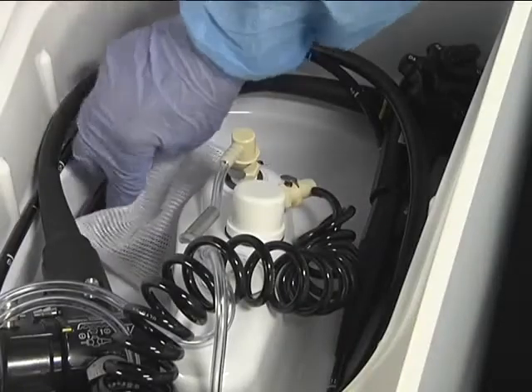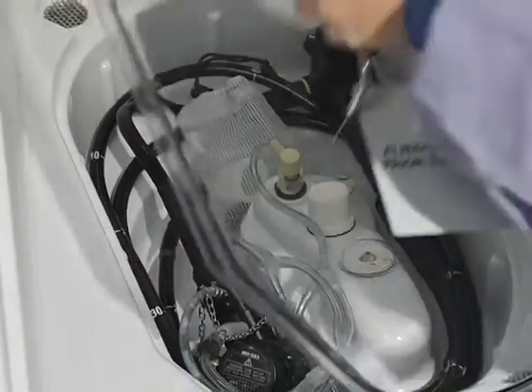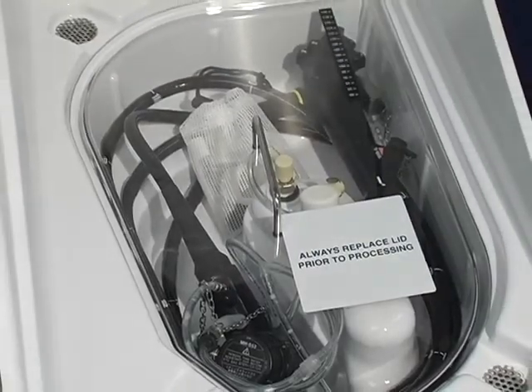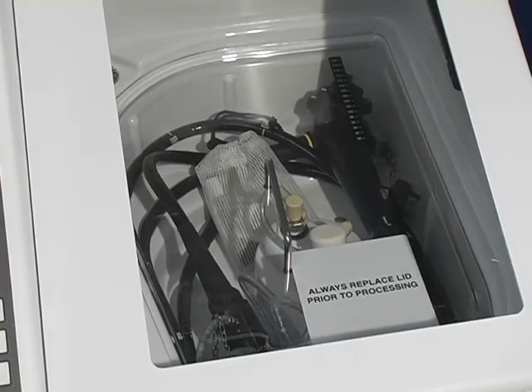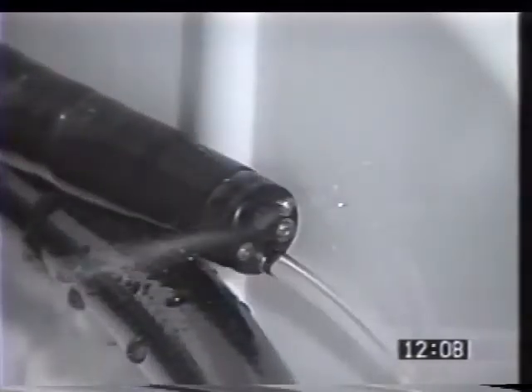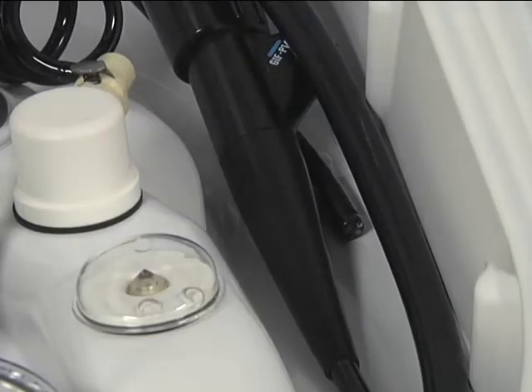Place the accessory bag in the basin, tucked underneath the scope to prevent floating. Place the floating lid on the basin. Make sure the endoscope is positioned so that the cover does not rest on the endoscope — if the endoscope or connectors touch the floating lid, reposition the endoscope. Close the station lid. The distal end should be positioned so that fluids passing through it are clearly visible and must not point upward toward the floating lid, to prevent fluid from going on top of the floating lid.